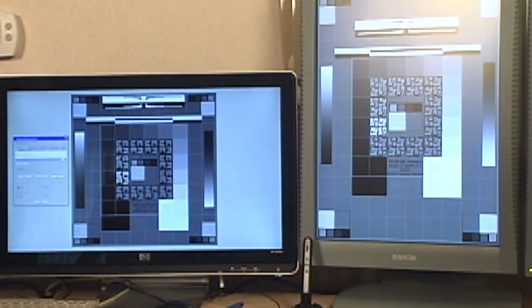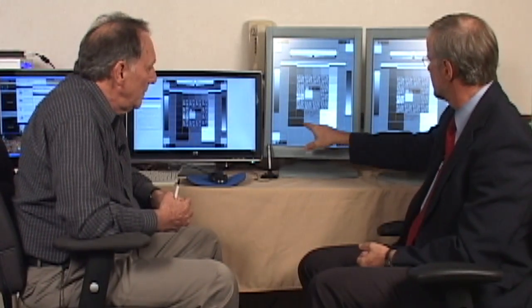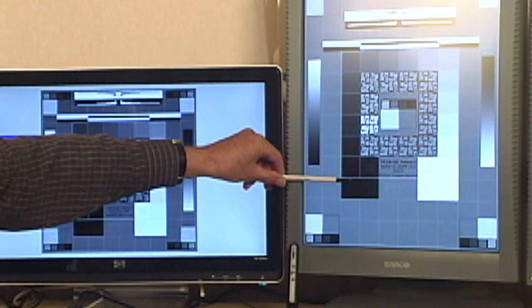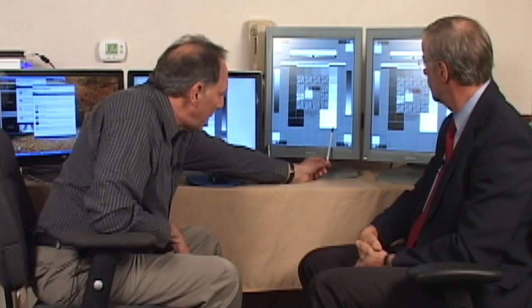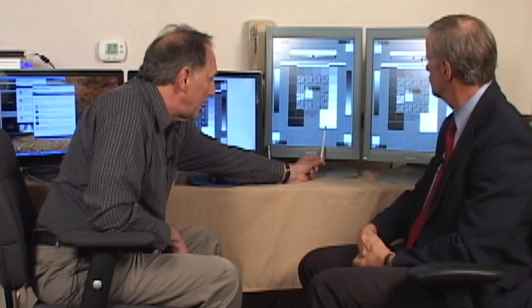All displays are sluggish. So if you don't necessarily need to look at the corners, there's also this text on the bottom, right? What we've done here is a nice quick visual test. If you're not getting into looking at the corners that sharply, the first square is at 0 level for its black, and then this is at the mid-level one, but it's 128, and this is at 255 for the background level. And because this is the brightest square, the L in the word control is 1 digital driving level down from 255, and each subsequent letter going backwards is 1 more step lower.